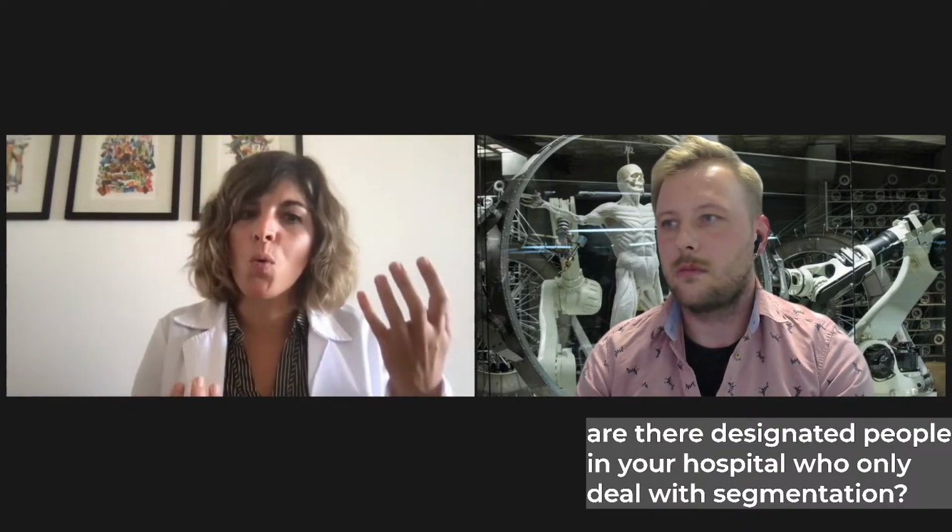You want everybody's help. Clinicians know what they need from you as image, and radiologists will help you to understand the image, so they help you as an engineer to know what to be part of the 3D model and to make the tool work in the most useful way.